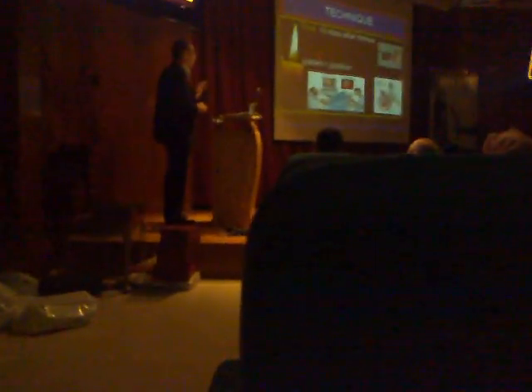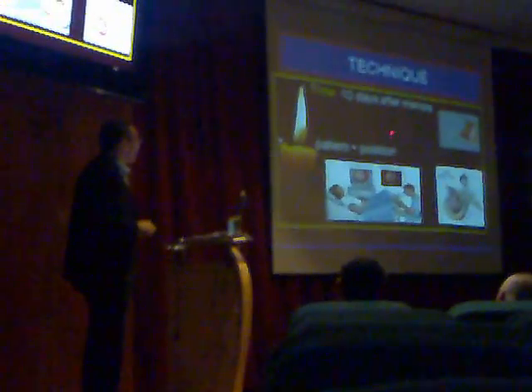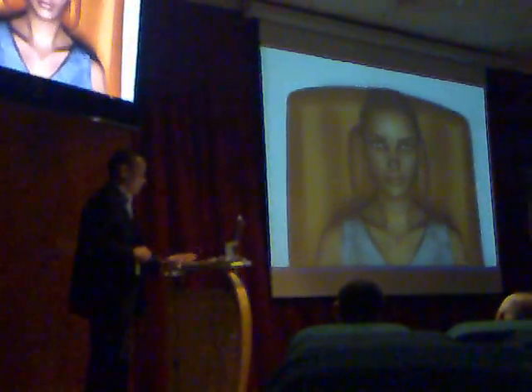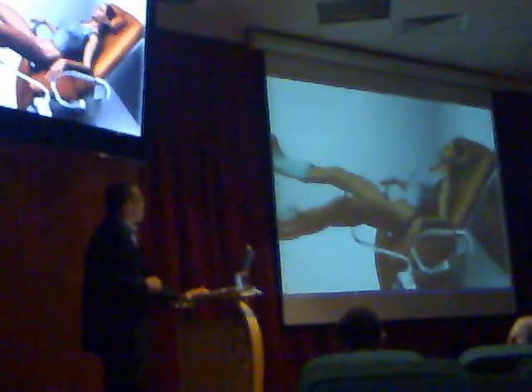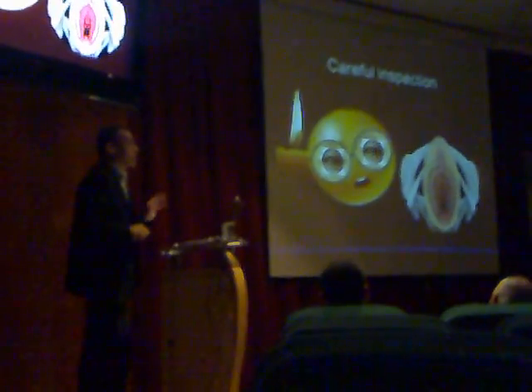A nurse or male or female doctor to take the lithotomy position, cover the patient, and start your work. And refers to the direct vision. Now, patient in a lithotomy position, cover. What are the first thing? First thing, use your eyes.